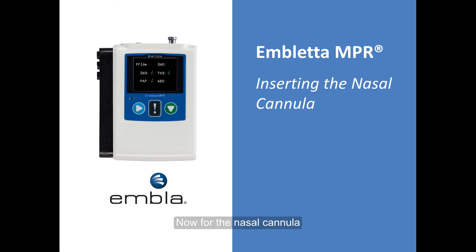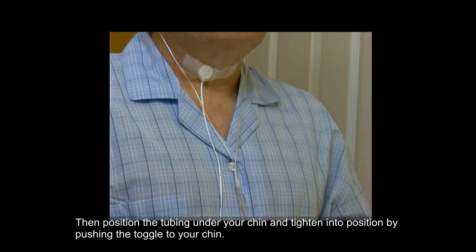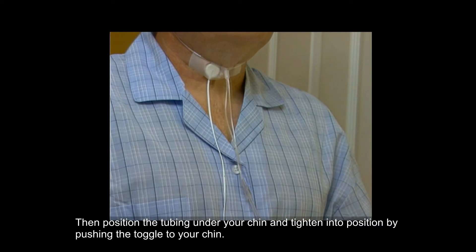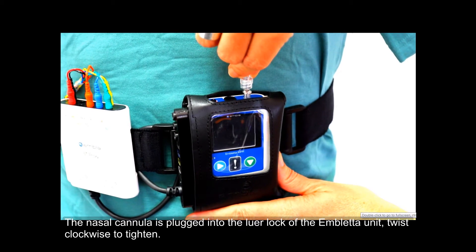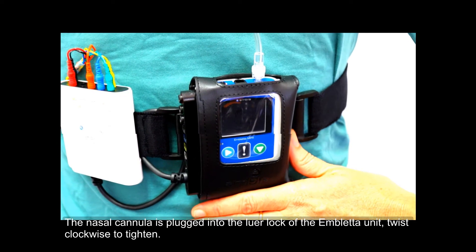Now for the nasal cannula. Place the prongs into your nostrils. Loop the tubing around your ears, then position the tubing under your chin and tighten into position by pushing the toggle to your chin. The nasal cannula is plugged into the luer lock of the Embletta unit — twist clockwise to tighten.